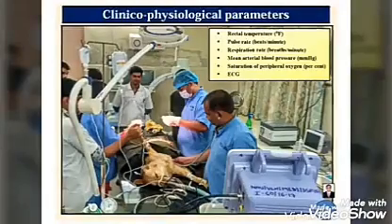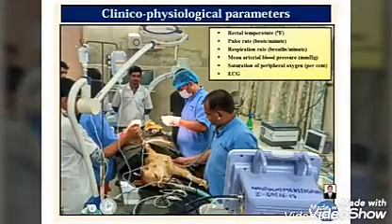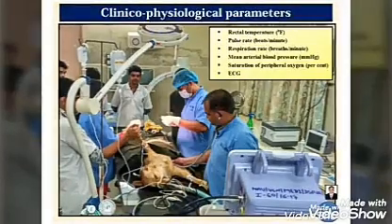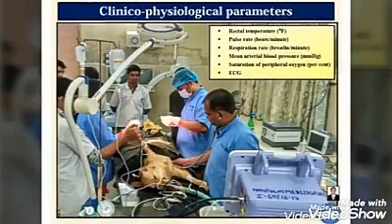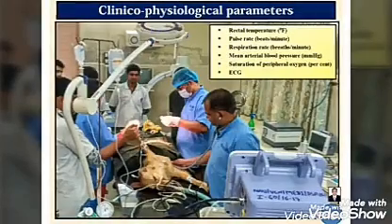So all these balanced anesthetic protocols are standardized by different institutes under the constant monitoring of various clinico-physiological parameters using the multi-para monitor and other sophisticated instruments like the recording of the ECG during the anesthetic periods.